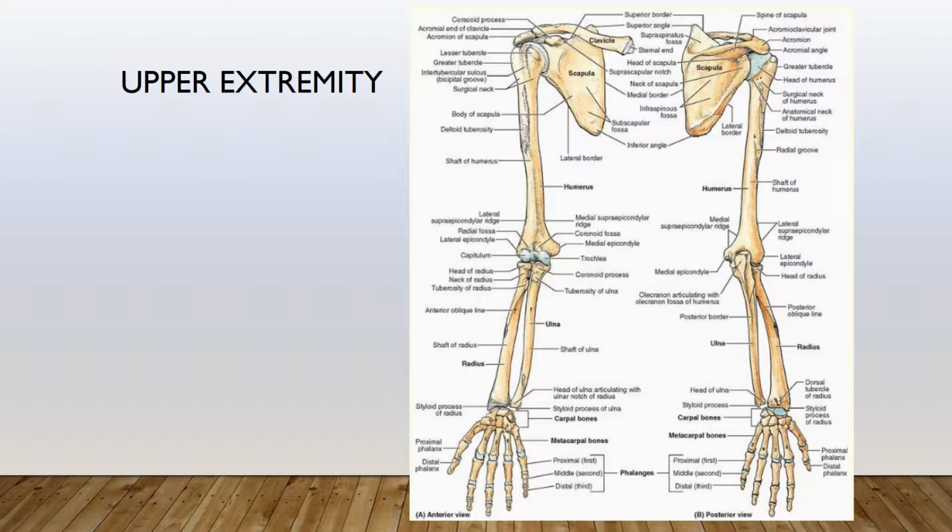And then I would also make sure that the diagnostic code was appropriate for my right hand 3-view. For example, if the diagnostic code said shortness of breath, that would not be appropriate for a right hand x-ray, and I would question that. But if the right hand x-ray diagnostic code said that it was for rheumatoid arthritis, then I can go ahead and start the examination.